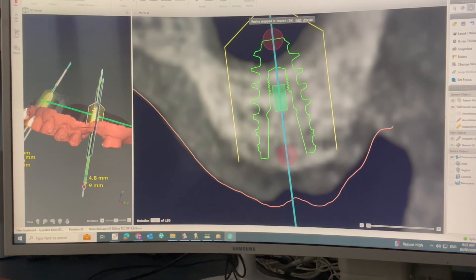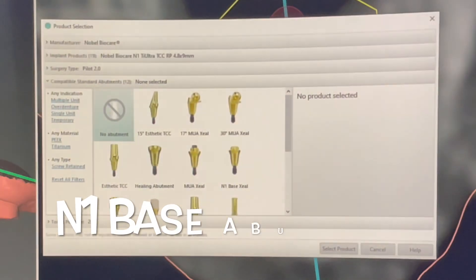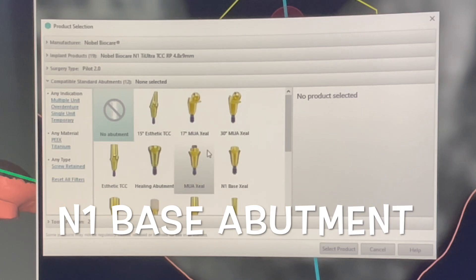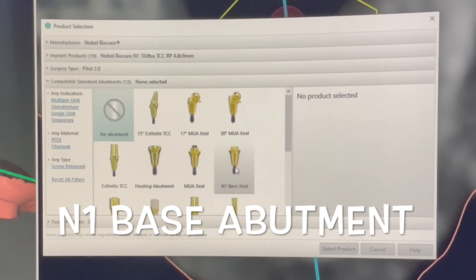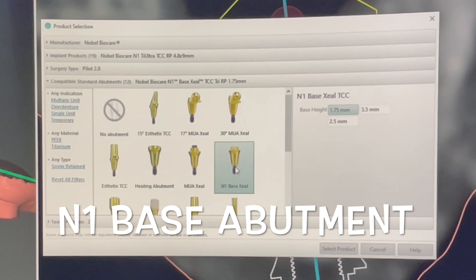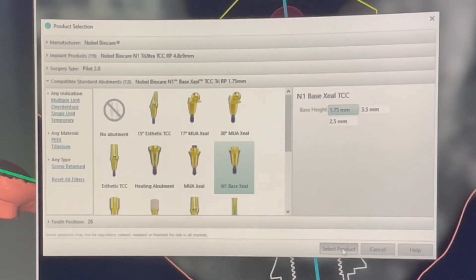It allows the patient to have a surgery that's not going to be overly post-traumatic for them and the post-operative sensitivity won't be that bad. We'll also be placing an abutment which is called a base abutment and we'll show you this in the surgery in just one moment. We're going to be getting started in the surgery.